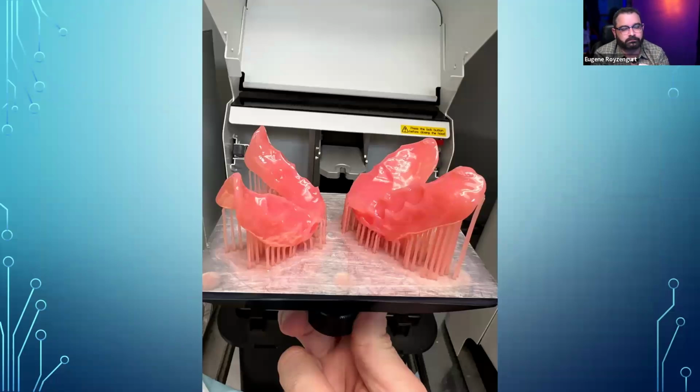Now, one thing I want to talk to you guys about is that whenever you're printing denture bases, it's important to remember what you're going to be using those denture bases for. If you're going to be relining at chairside, then obviously you can place your supports on the intaglio surface because you know that surface is going to be relined. If you're not going to be relining, if you want to do it right from the start of fitting inside, then you don't want to do something like this. You want to place your supports more on the facial surface, like bringing it upside down.